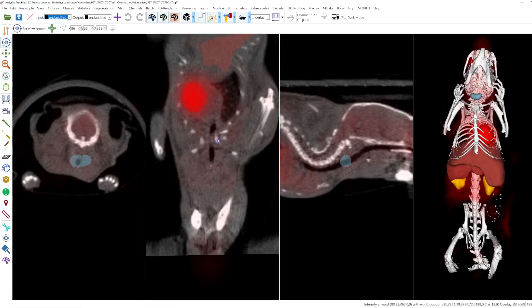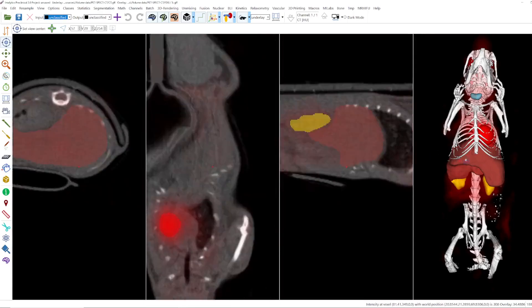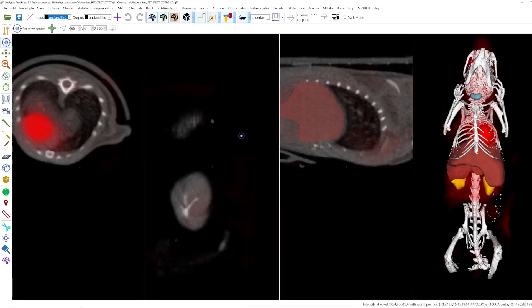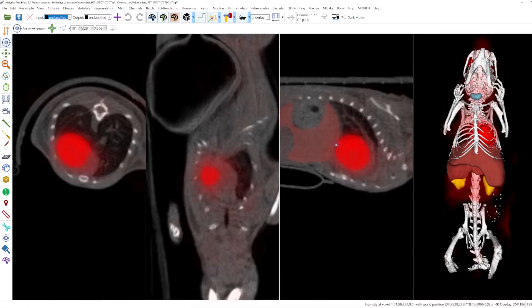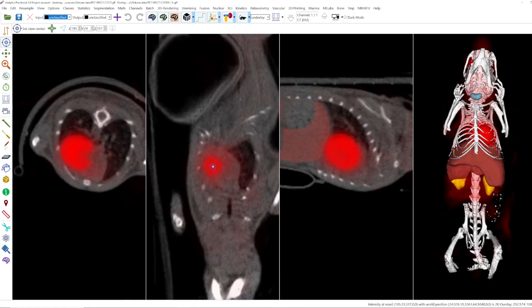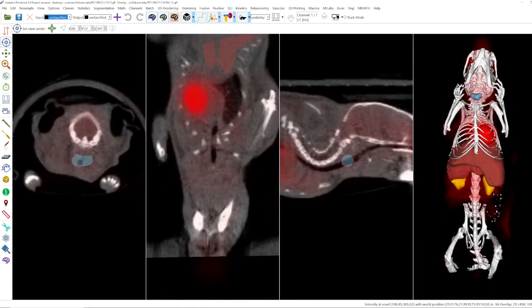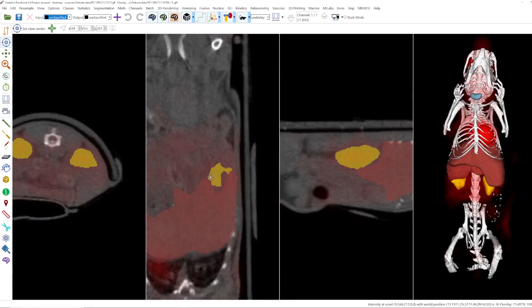So it's quite simple, you can just click somewhere in 2D or in 3D and your 2D slice views will focus on that. For example, now I click into one voxel of the heart and all 3 slice views are in the heart now. It also works in 3D — for example when I click on the thyroid, the slice views jump to the thyroid. Or when we go to the kidney, the slice views focus on the kidney.